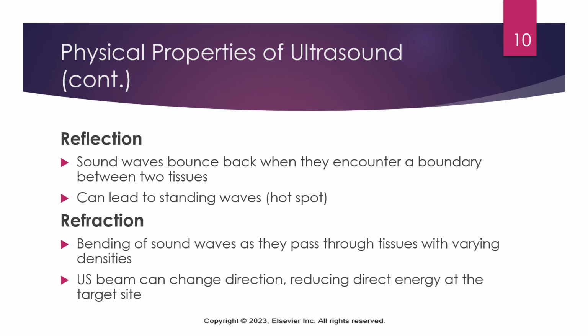Refraction is essentially the bending of sound waves as they pass through tissue with varying densities. So muscle belly can be pretty dense as opposed to just skin or as opposed to adipose tissue. So it depends on the density, right? Different types of densities will bend those sound waves.